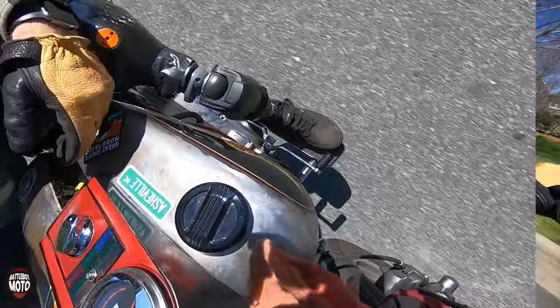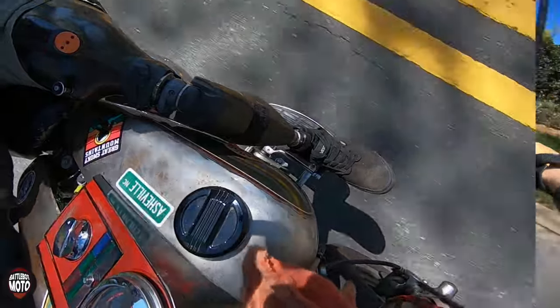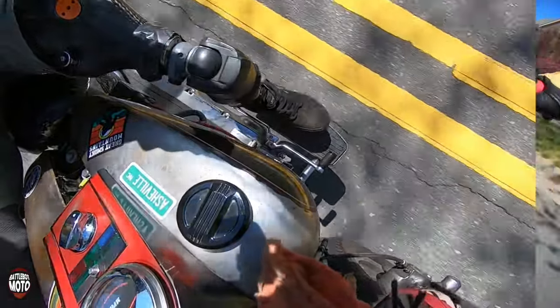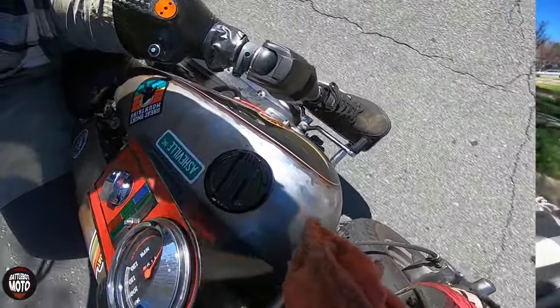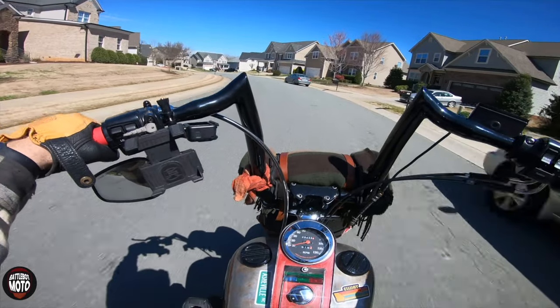When I want to downshift, I pick my foot up and put it over the toe shifter and let it hover. Then when I'm ready to downshift, I clutch in, stomp down, then lift my foot back up, place it on the floorboard, and I'm ready to go.